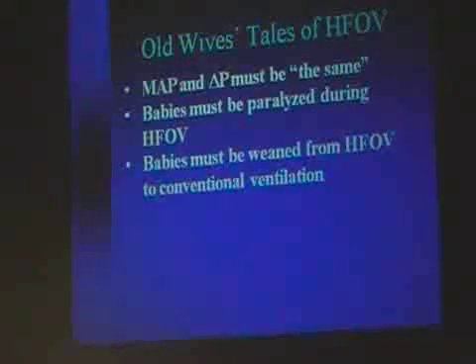Babies must be paralyzed during HFOV. We don't do that anymore, but it used to be thought that should be done. It's actually quite comfortable. When HFOV was first being tested, some adults tried it. They had themselves intubated, and it's a little bit farther along than I would go, I believe. But afterwards, they said it was extremely comfortable, and that they didn't want to breathe. When it was an appropriate setting, they lost their desire to maintain their own spontaneous respirations.